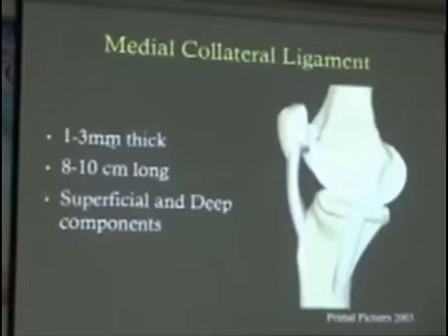And it's around about 10 centimeters in length, so it actually extends a long way down into the tibia here.